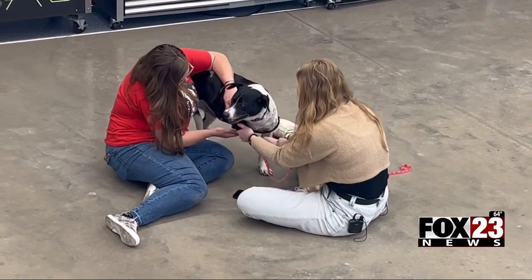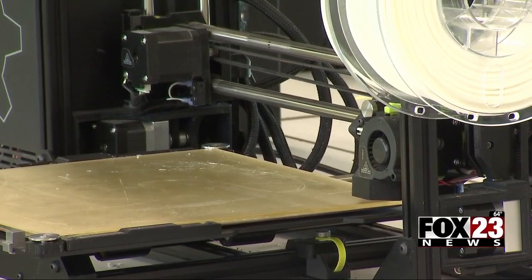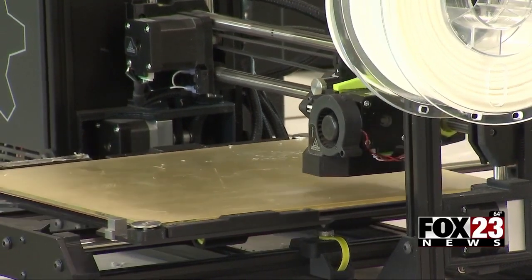I think there's a lot of animals that need help. It's all thanks to Vanguard Academy's Explore class, which is based around creating a project. We create all of it — we go with whatever idea we have. We try to do something big, something maybe to help the community, help Vanguard. Brooke is using the Vanguard Academy's 3D printers to create this prosthetic frame. After trying it on and taking measurements, the piece will be further refined using a more flexible filament.